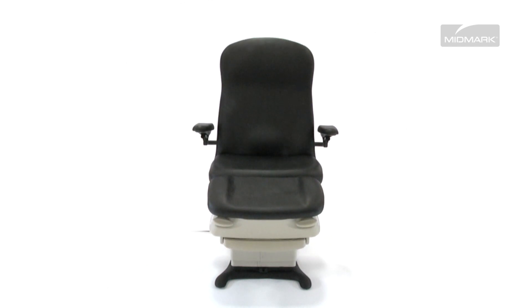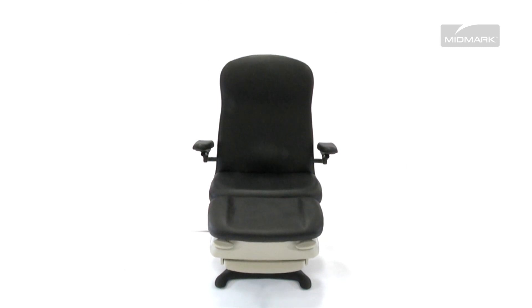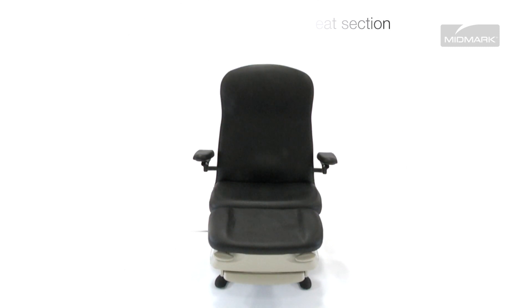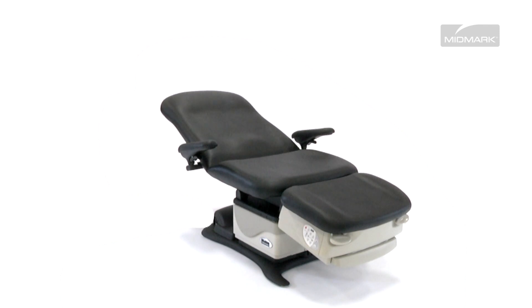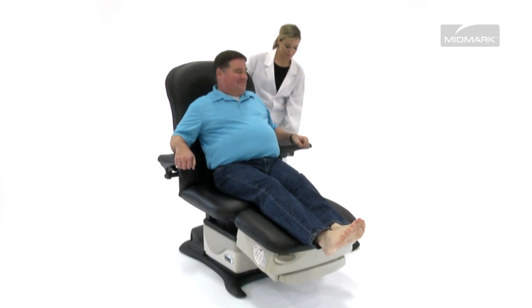The 19-inch barrier-free low height can make accessing the chair easier for patients of all sizes and physical condition. The chair is 28 inches wide at the seat section and can be laid flat for a larger, flatter surface to help make patient transfer easier and safer. Chair arms offer the patient a sturdy platform for accessing the chair.